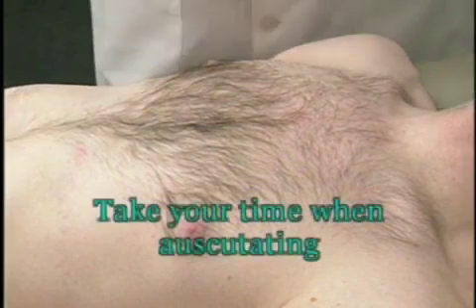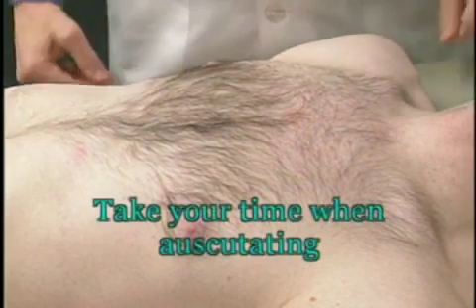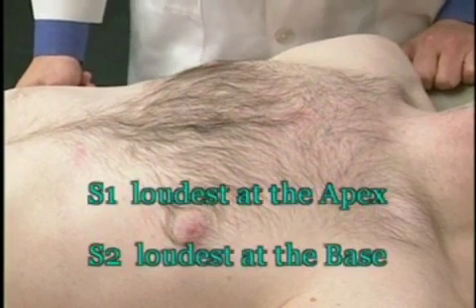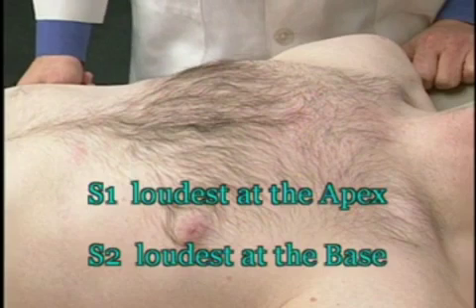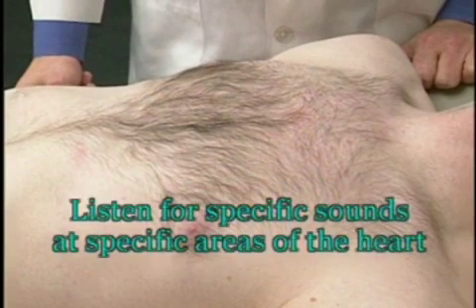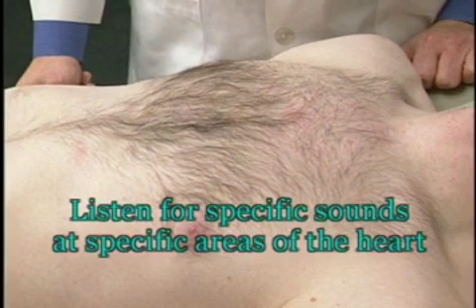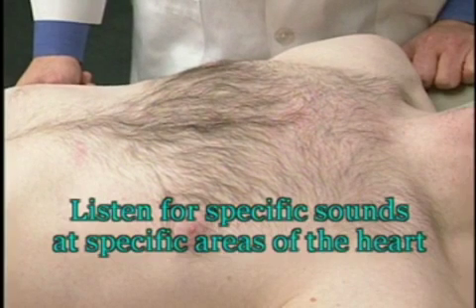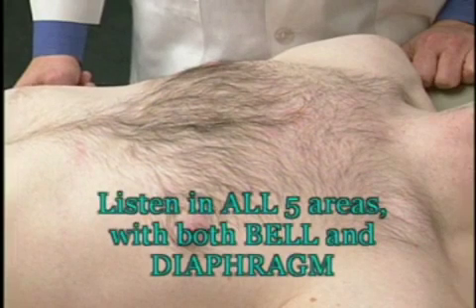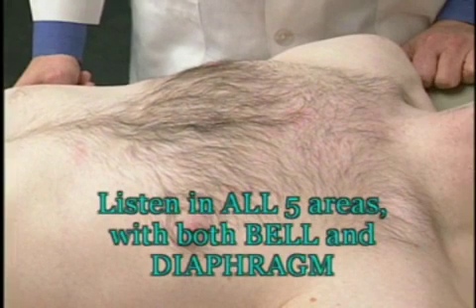And take your time when you're auscultating. You'll know that there are specific sounds that are heard loudest at certain locations. Again, S1 is loudest at the apex, and S2 is loudest at the base of the heart. Take time to listen in each area and concentrate your attention and focus on the things that you know belong in that area of the heart. And remember to listen in all 5 areas with both sides of your stethoscope.